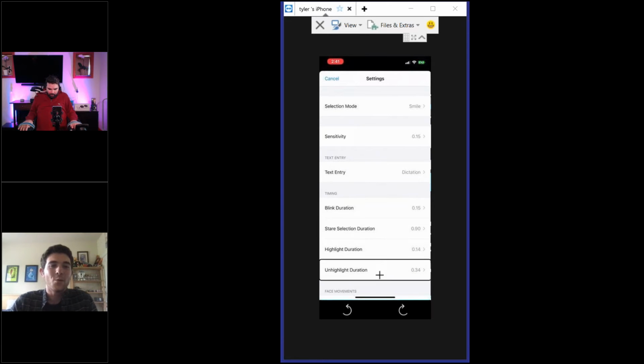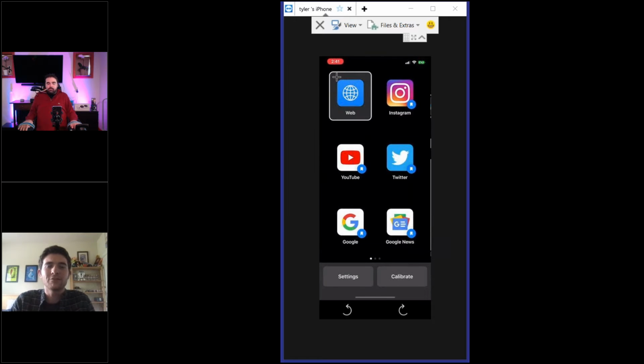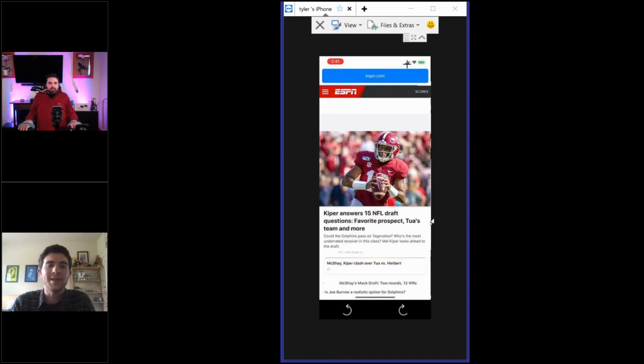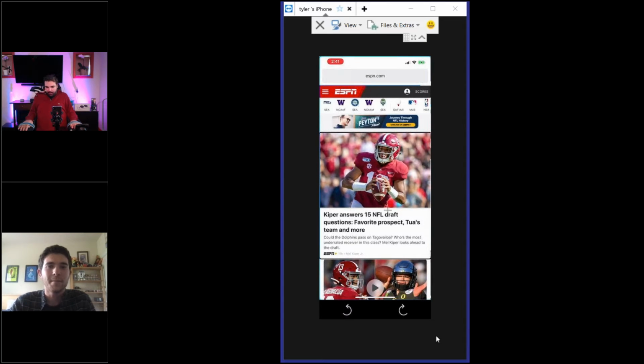Yeah. I mean, we're pretty dependent on iOS at this point for our dictation, but I think clear audio is definitely the biggest helper there. So if you can do it without a lot of background noise and that sort of thing, then the dictation's really pretty good at this point. And because it's not really trying to interpret what you're saying, it's just trying to do speech to text, it's pretty accurate at this point, which is really good.